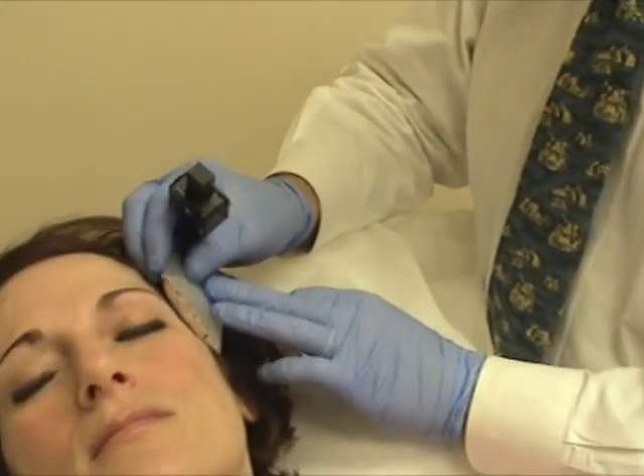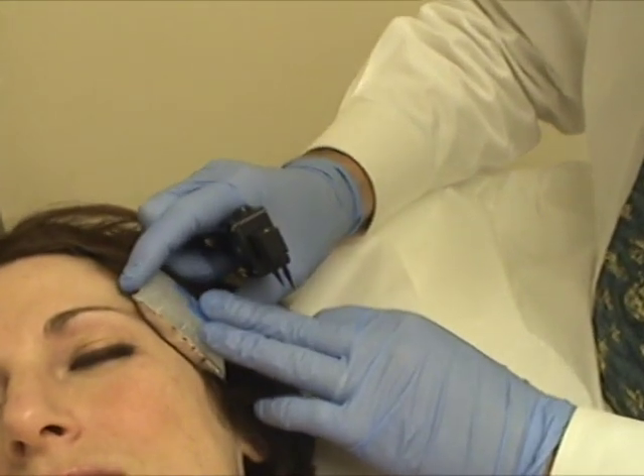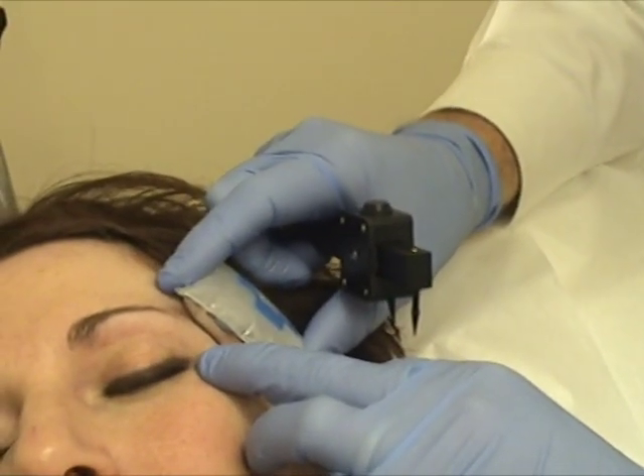We're going to inject zone 2, and we're going to use double dilute again, so that's 4 cc's per 100 units, and once again we're going to use 12.5 units per side.